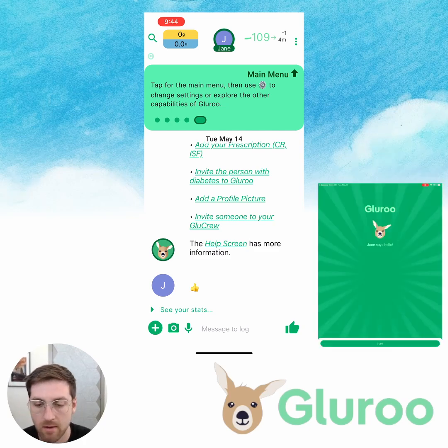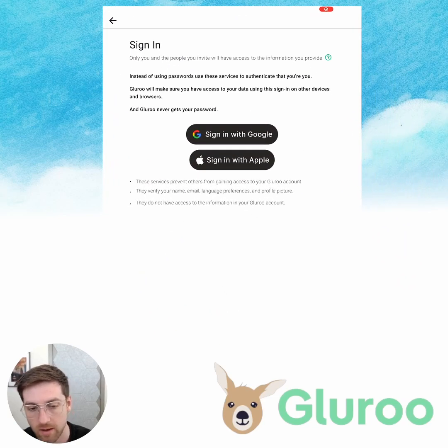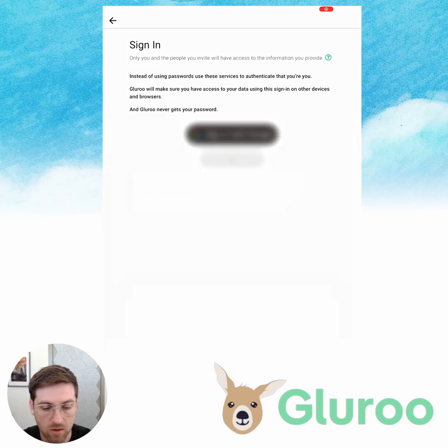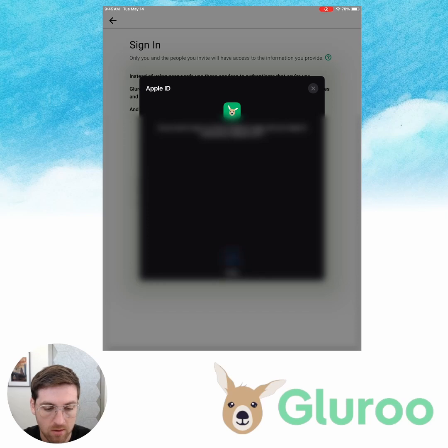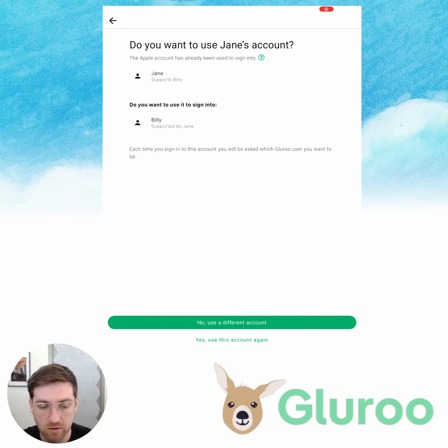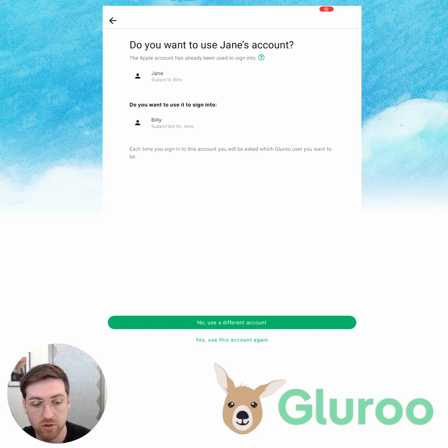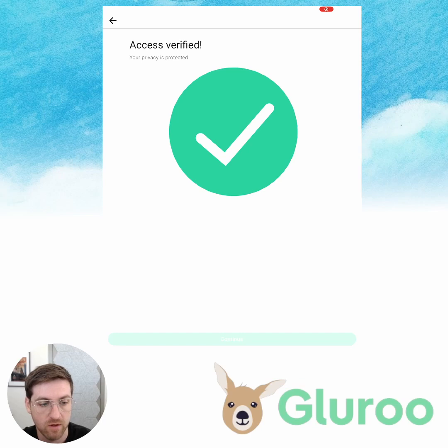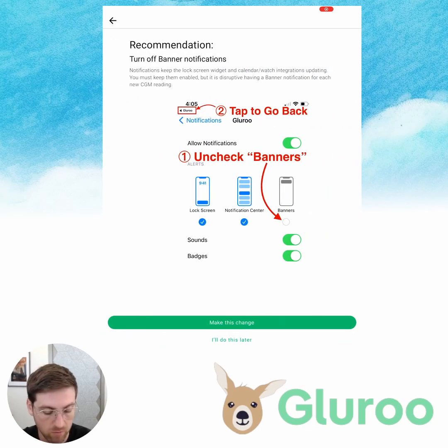Now I'm switching back to the iPad. I'll hit Start and sign in with Apple. Both of these iOS devices are using my own Apple ID as their system Apple ID. Now we see that the Apple account has already been used to sign in as Jane, who is supporting Billy as the person with type 1 diabetes, and it's asking if I want to use it to sign in as Billy, who's being supported by Jane. So I can select which account to log in as — on the iPhone we're already signed in as Jane, so on the iPad I do want to sign in as Billy. I'll say yes, use this account again. Access verified, and we need to accept the terms — we've already read the privacy policy on behalf of Billy, so you can tap through that easily.